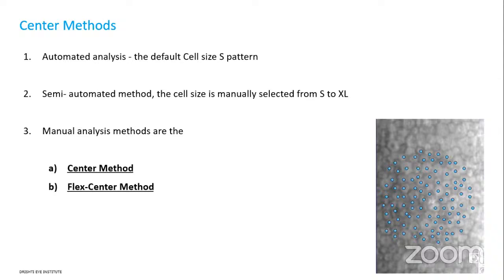Dr. Ruchika, in such cases where the specular cannot visualize the endothelium because of poor clarity or the cornea not being very healthy, do you think the clinical method is much superior and can still help you, or what else can you do in those cases? So all said and done, we have to correlate clinically at the end of the day because, as discussed already many times, we get an overestimate of the cell count, but clinically the picture looks quite different.